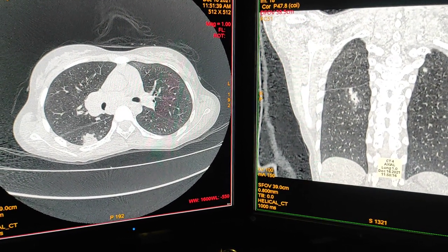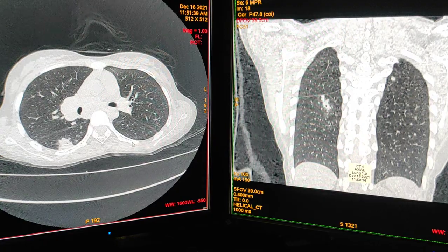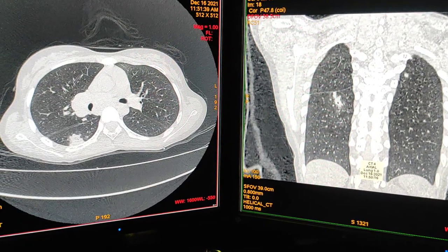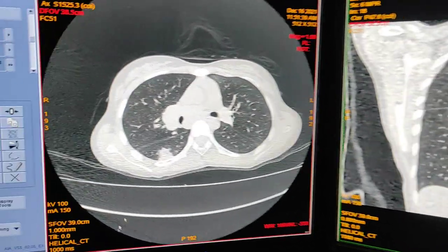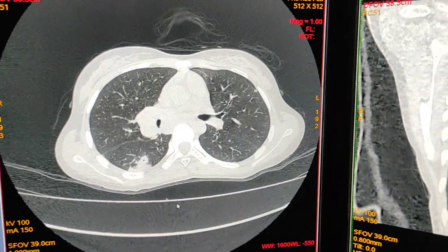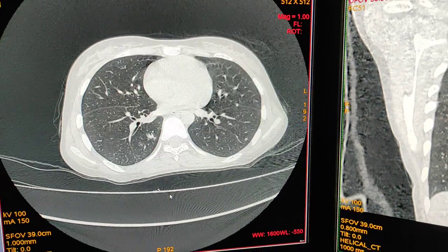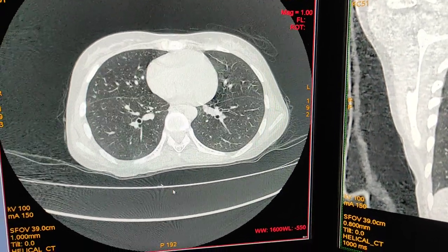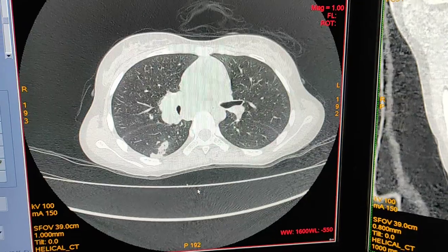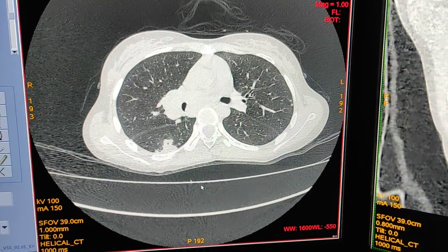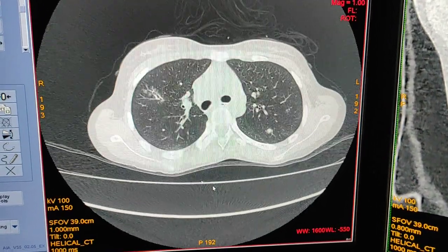This is HRCT lungs to rule out tuberculosis. I'm showing you the axial image of HRCT lungs; the protocol is 1 mm thickness, and this is a reconstruction of the axial images.